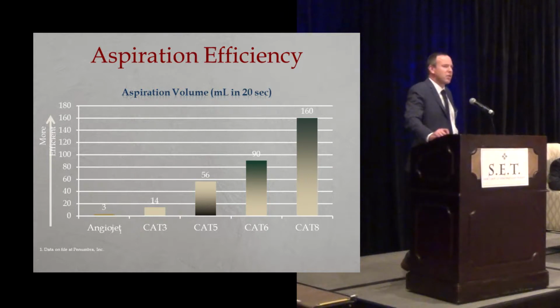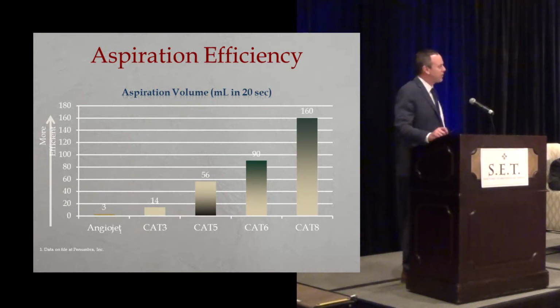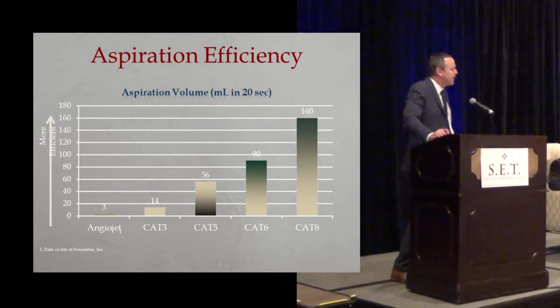When you take a look at the overall aspiration efficiency between the different catheters, you can see here the Cat 8 is the most powerful, so you do need to be a little bit careful when you're using it. You want to make sure that you're in clot, because if you're not in clot, you'll aspirate a fair amount of blood relatively quickly because it works so well. Compared to the Cat 6 and the Cat 5, the aspiration volume is much higher, but most of those will aspirate a volume that's even greater than the AngioJet itself.